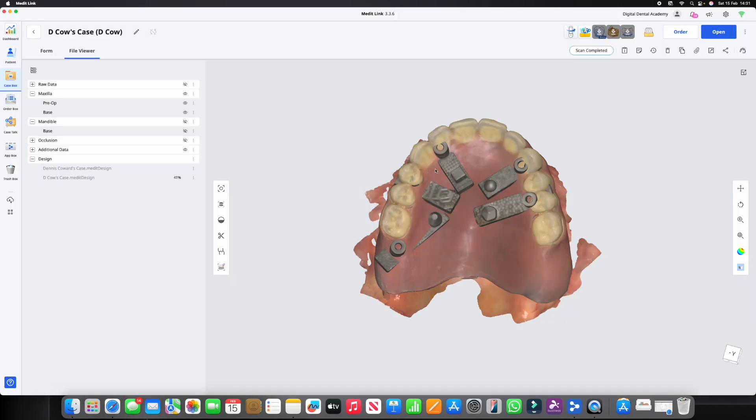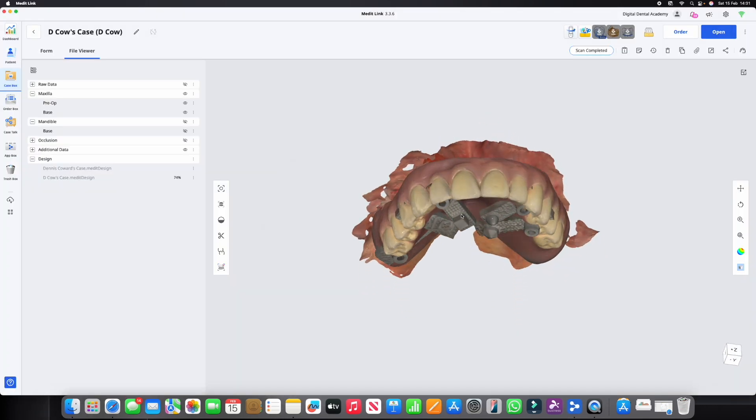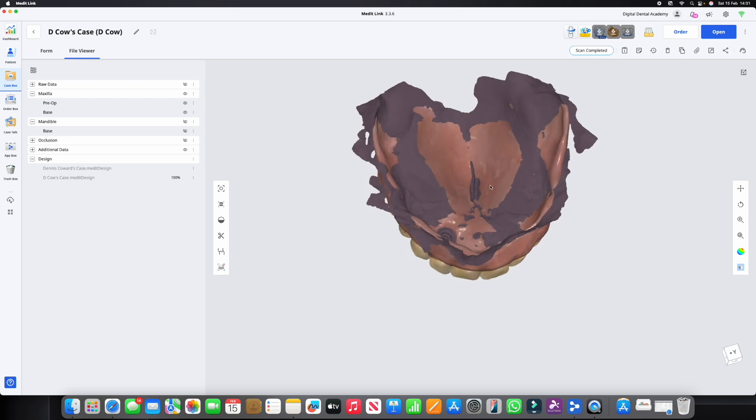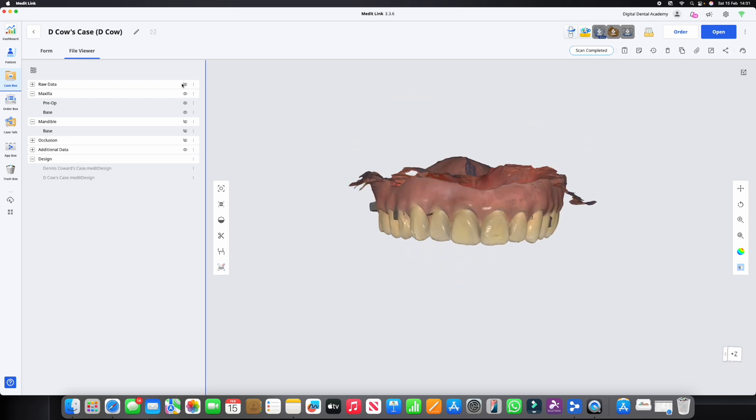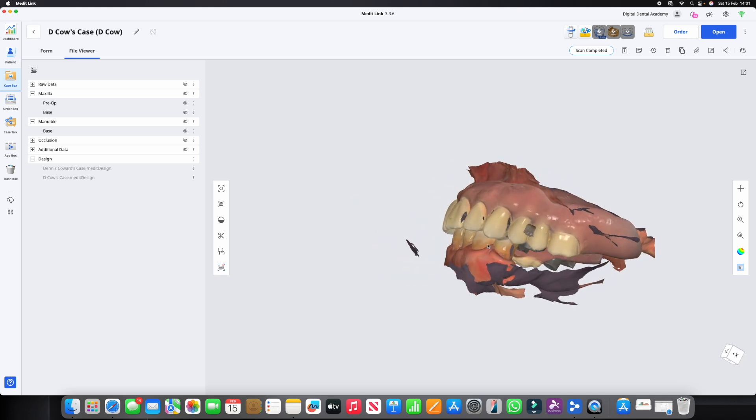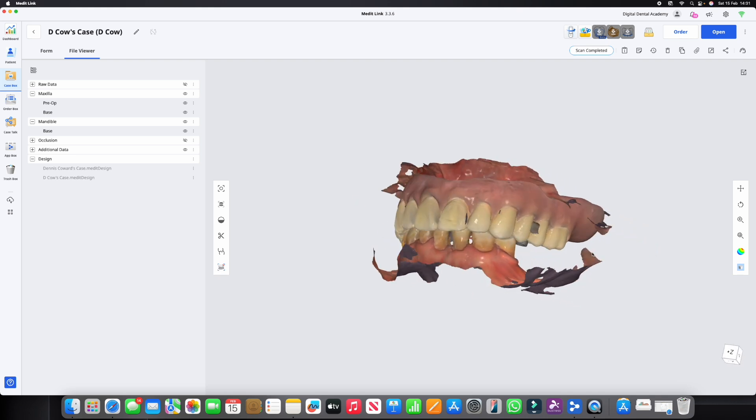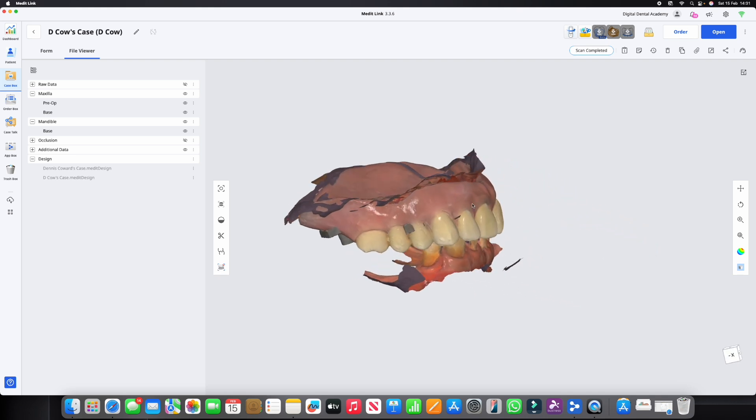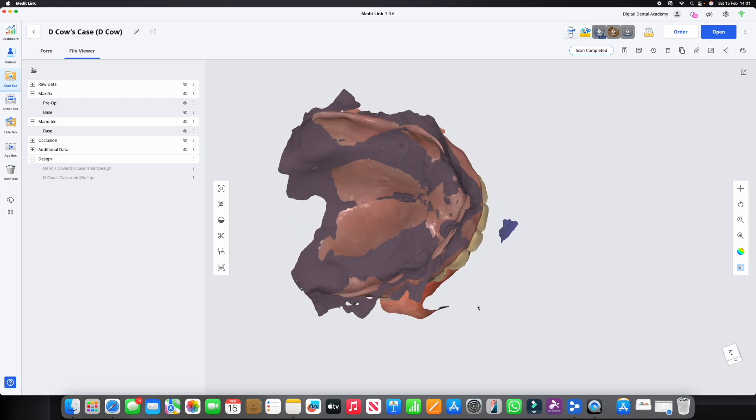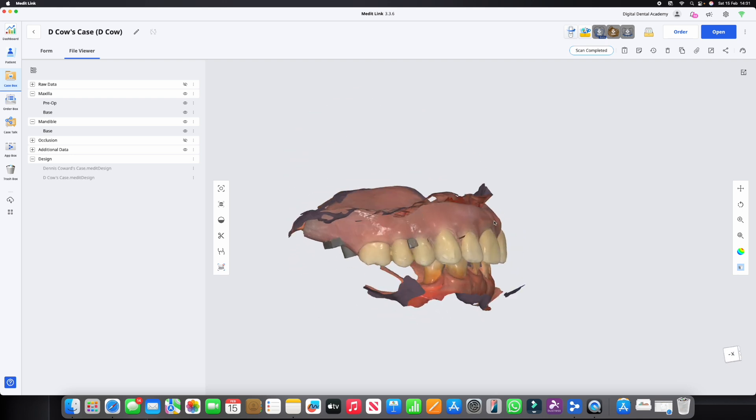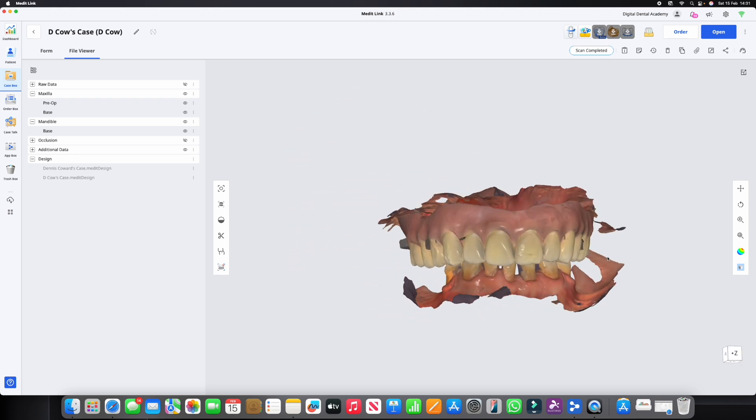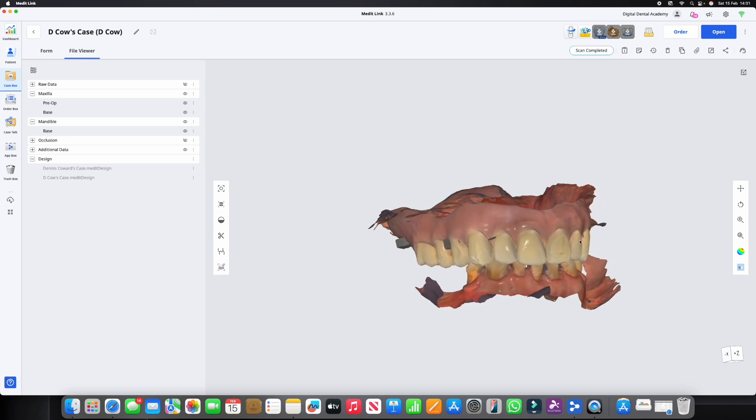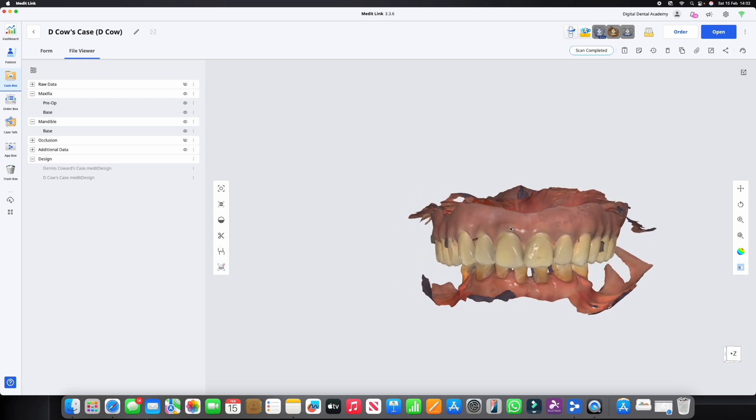Here we go. And now if you look, everything is aligned perfectly. If I turn on the mandibular scan here, we've got the OVD, we've got that bite that's registered with the denture, we've aligned the two denture scans automatically, and now we have everything that we can export, take into exocad.